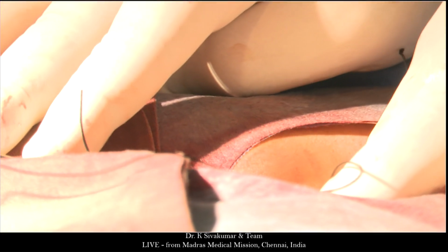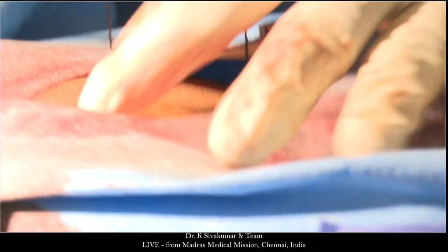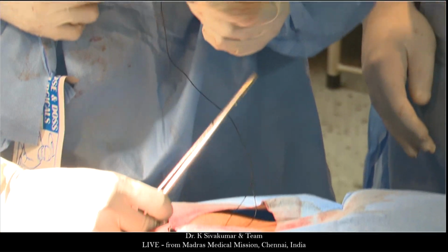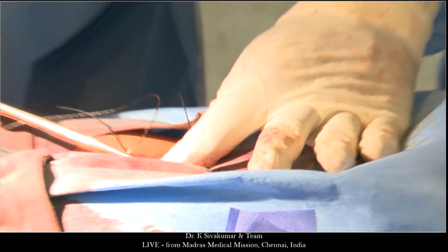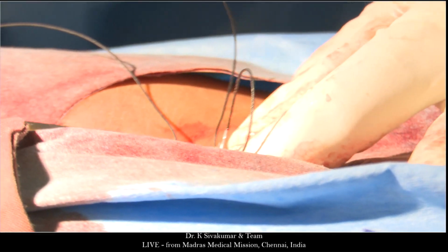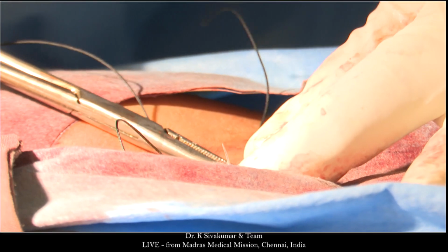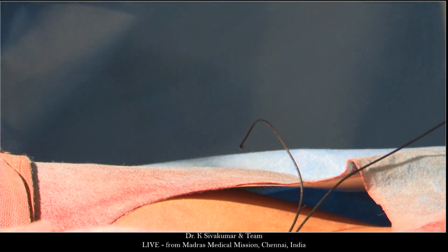Are you talking about an additional associated secundum ASD, or the sinus venosus defect size itself being large? If the sinus venosus defect is really big, we have written in our original paper in Circulation Interventions that if there is a substantial caudal extension of a sinus venosus defect, patients are less likely to be completely occluded.